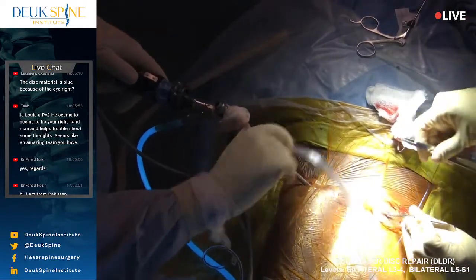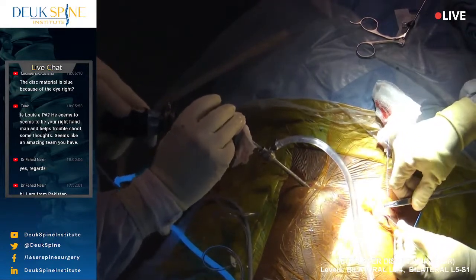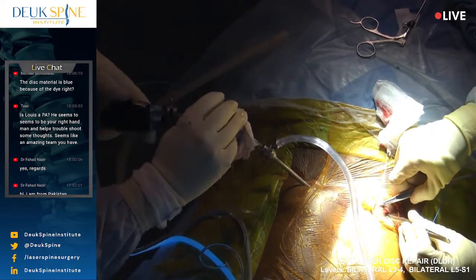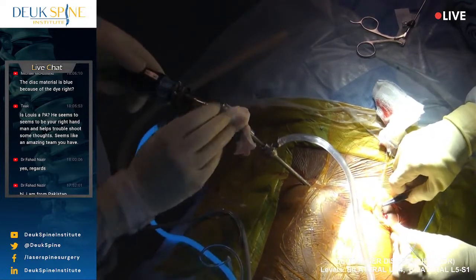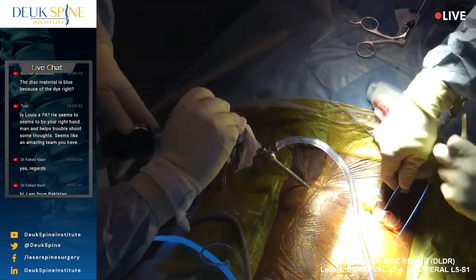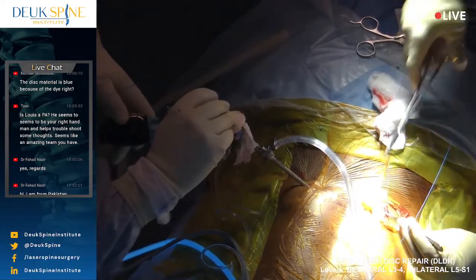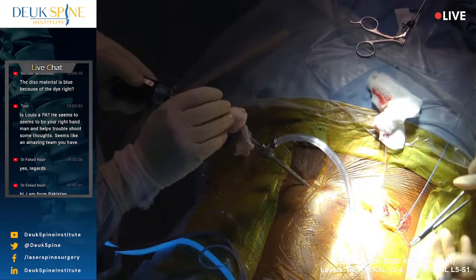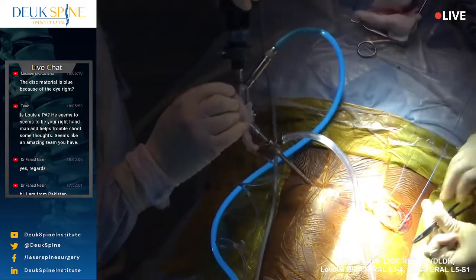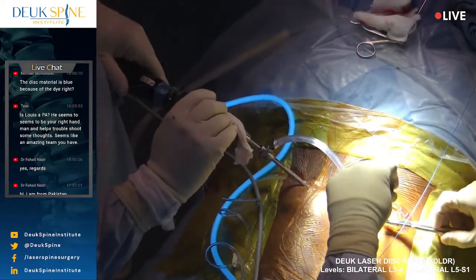Unfortunately, there's a little more oozing with this case, with this disc. It's not uncommon when you have a little bit of bleeding because you did the other side already. Discs don't have much blood, but they do have a little bit.